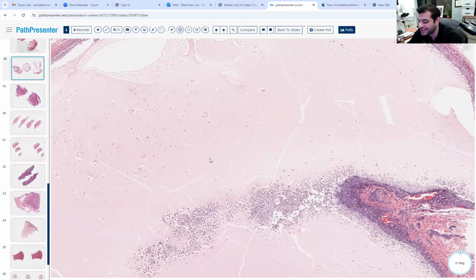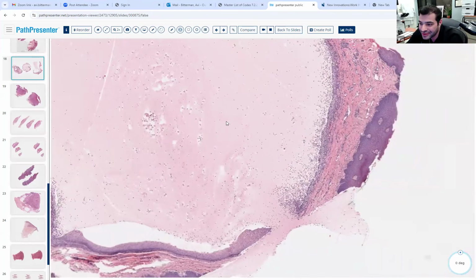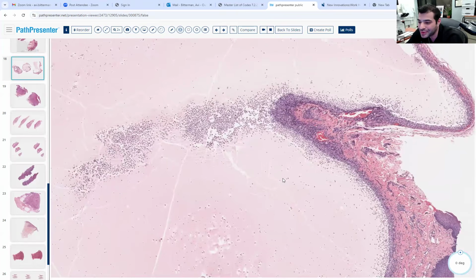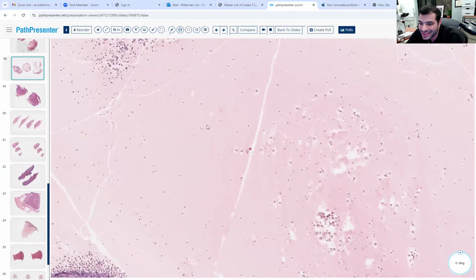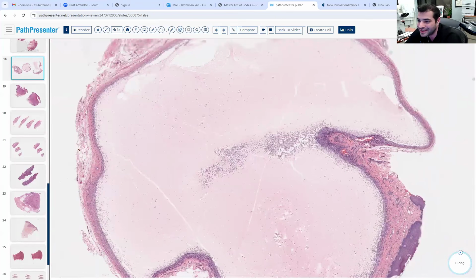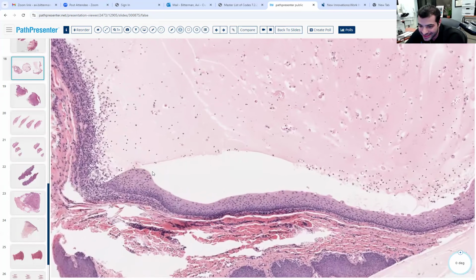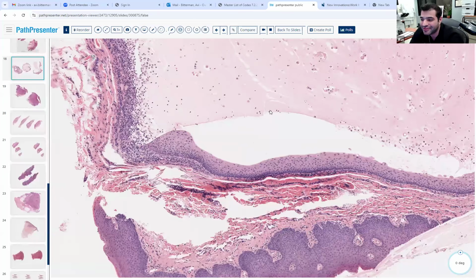I have to look into what the exact composition of a mucocele is, but I don't think it's just sialomucin or any of the three mucins. It's a mucoid substance. But yes, this is typical for how the substance would look. Sometimes you don't get this, by the way. Sometimes in the processing, this could all shell out and you have to infer. You'll get something like this, where you see how it's already starting to cleft out, and you kind of have to infer it.